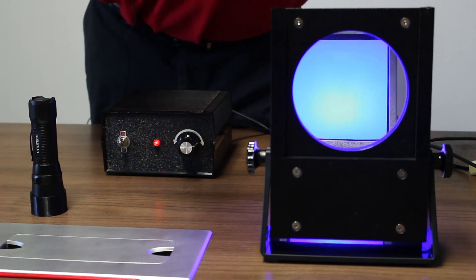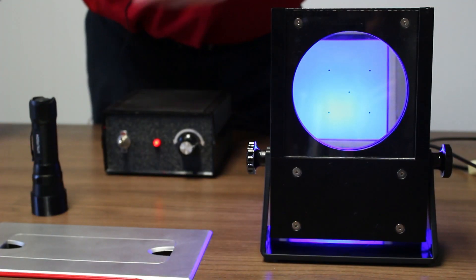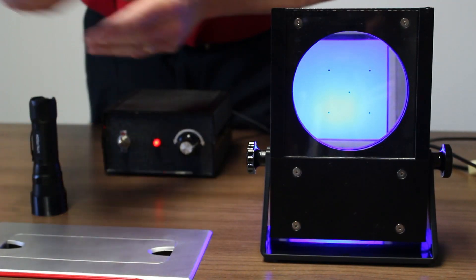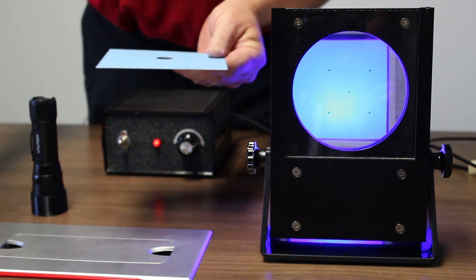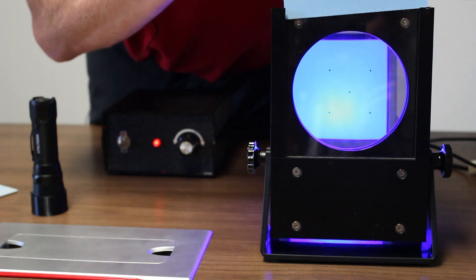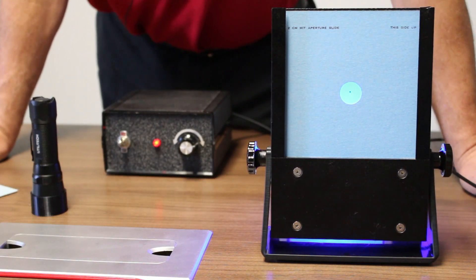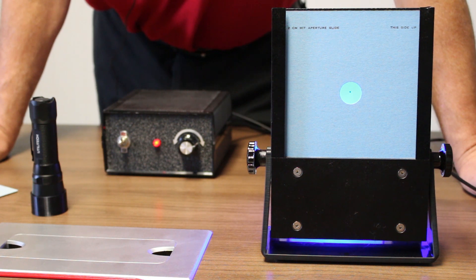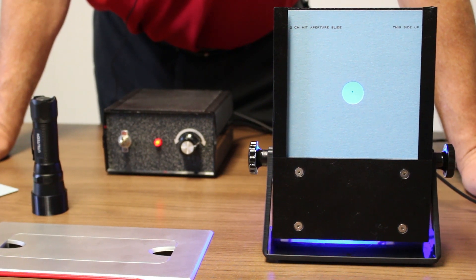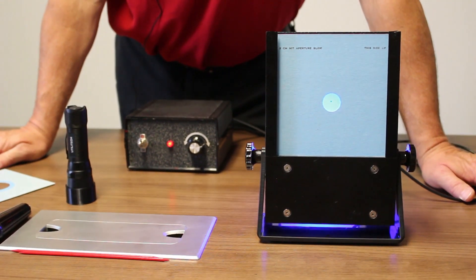If we take the standard card, put it in front, and isolate only on the center dot, you can use these apertures to control what is seen. You should see one black dot there. When they're looking at that dot, if they have normal fixation, the propeller will be spinning around the dot.